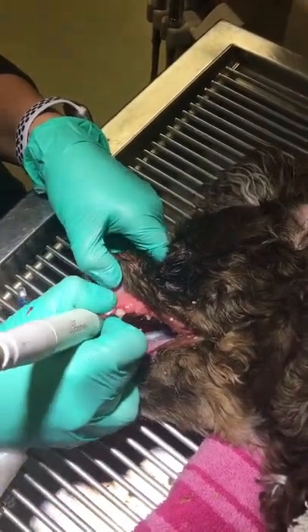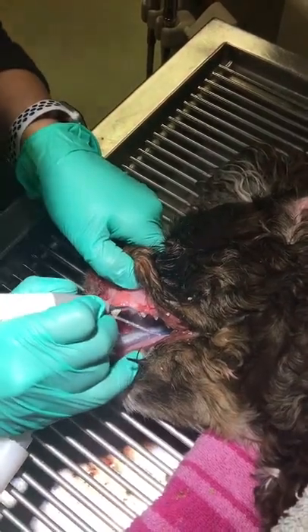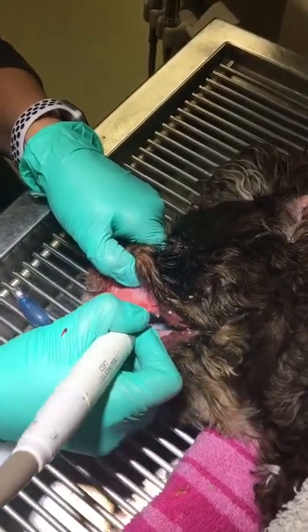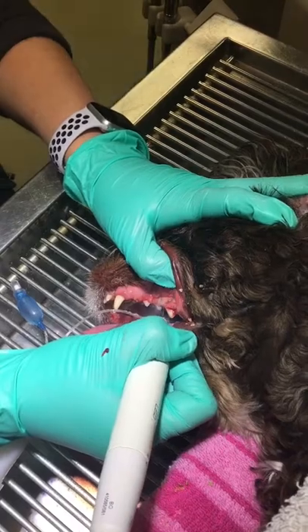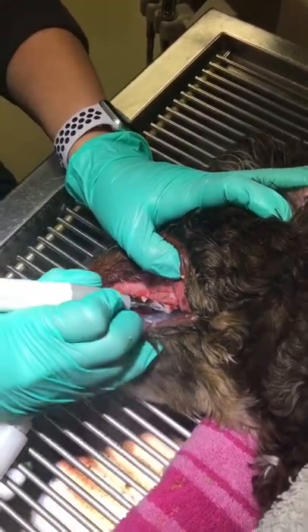Lightly hold the ultrasonic scaler in your dominant hand between your thumb and index finger like a pencil. The scaler tip should never be directed at a 90-degree angle towards the tooth surface because the tip will cause damage to the enamel. Correct angle of the tip should be held at an angle of 0 to 15 degrees from the long axis of the tooth.